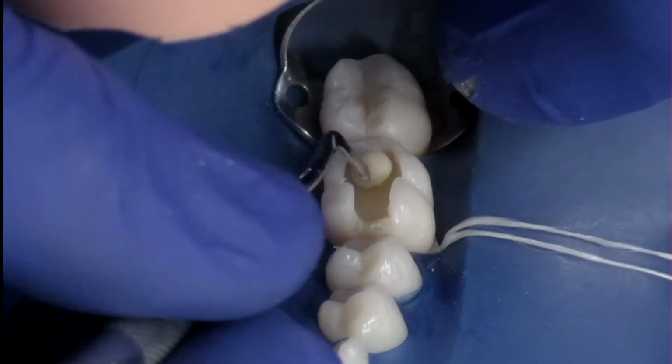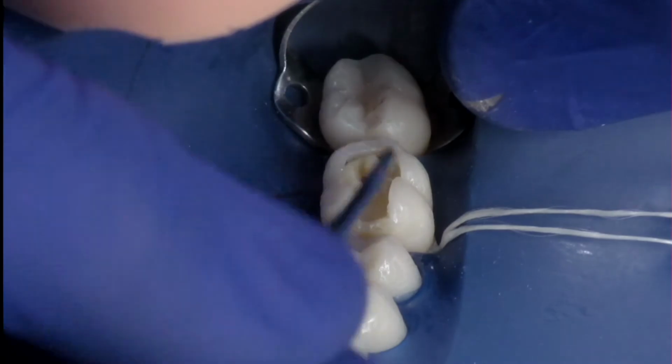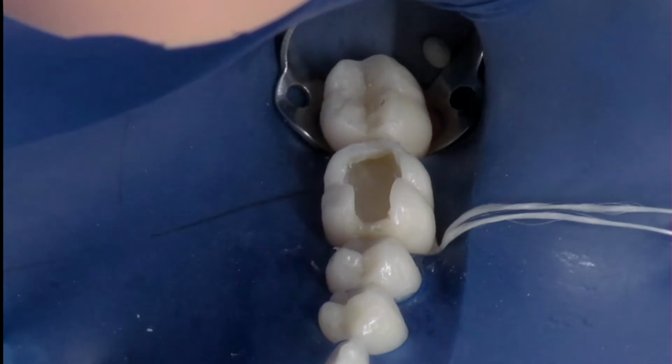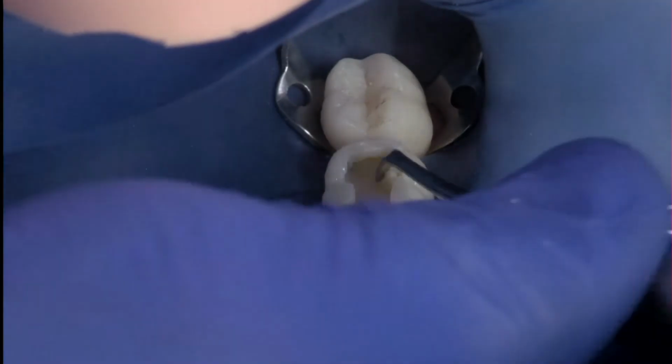Now I'm trying to do a lobule-based composite application. My goal is to place two balls of A3 at each cusp location, and then finally finish it up with an enamel shade, and then fill in the fossae with enamel.